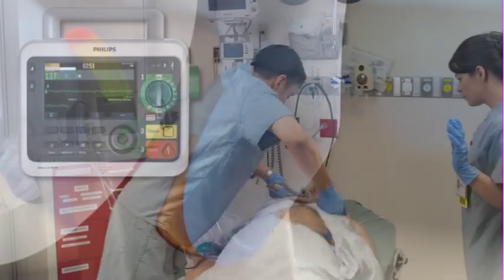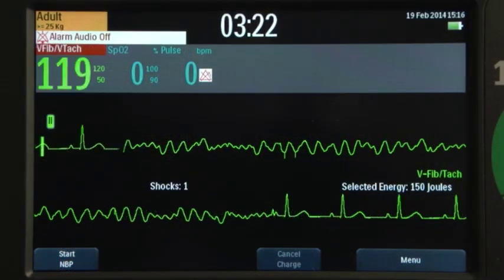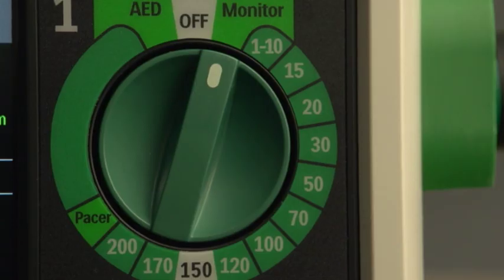Upon delivery of the shock, the DFM 100 announces "shock delivered." Following successful defibrillation, once you confirm a stable heart rhythm, return the therapy knob to monitor.